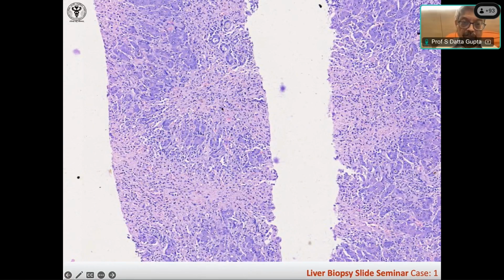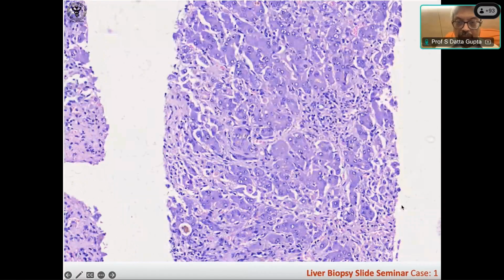And in this area, there are no hepatocytes. We don't know whether it's fibrosis or what it is. And there are hepatocytes here, okay. Same somewhere here also, you're finding these under higher power. They're actually not ballooned, you know. Ballooned means they should be watery and clear. Some of these could be fat-like. And here there are inflammatory cells. Same thing here. And here maybe bile.